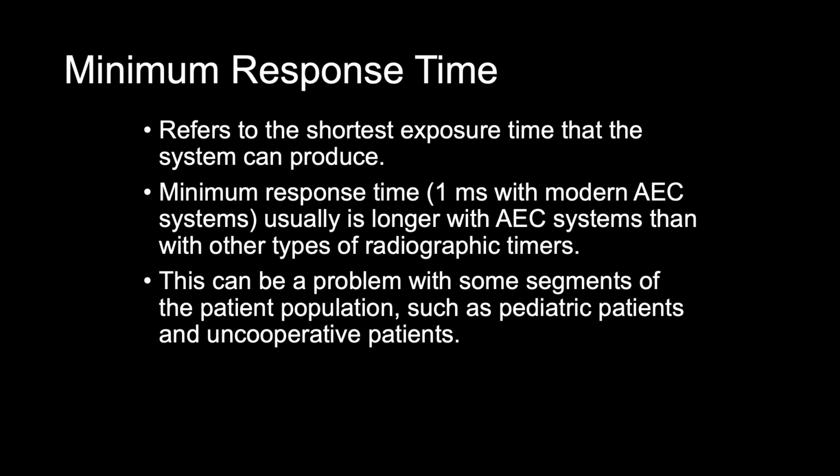We want to increase the mA so the time of exposure terminates more quickly. If the minimum response time is longer than the amount of time needed to terminate the preset exposure, then an increased amount of radiation is going to reach the image receptor.